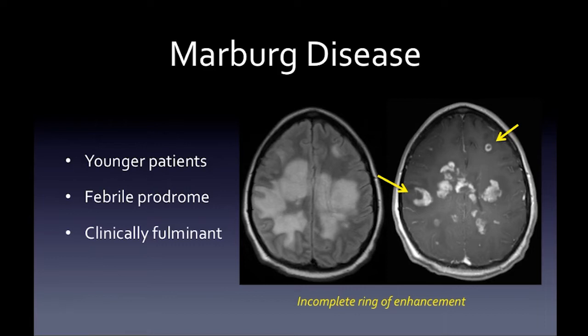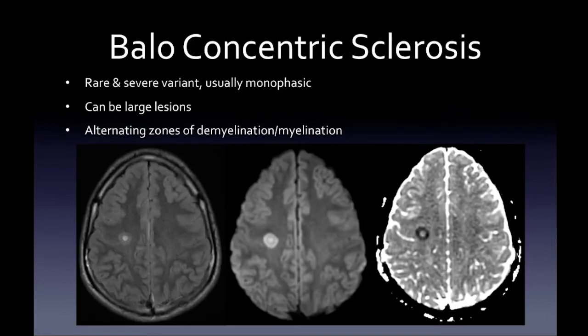Marburg disease is a clinically fulminant variant of demyelinating disease, usually in younger patients with a febrile prodrome. You can see widespread demyelination, but some lesions show the incomplete ring of enhancement — the tip-off that this is a demyelinating process rather than something infectious or metastatic. Balo concentric sclerosis is another rare and severe variant, usually monophasic, with lesions showing alternating zones of demyelination and remyelination — a target-like appearance.